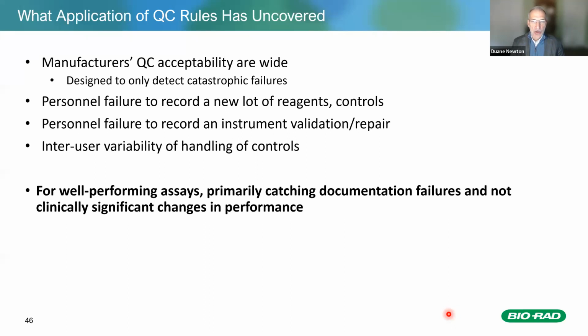At the end of the day, though, if your sigma values are really good enough, it's likely okay that the manufacturer's QC ranges are high, but you can't just assume that without looking at the data and calculating those sigma values.